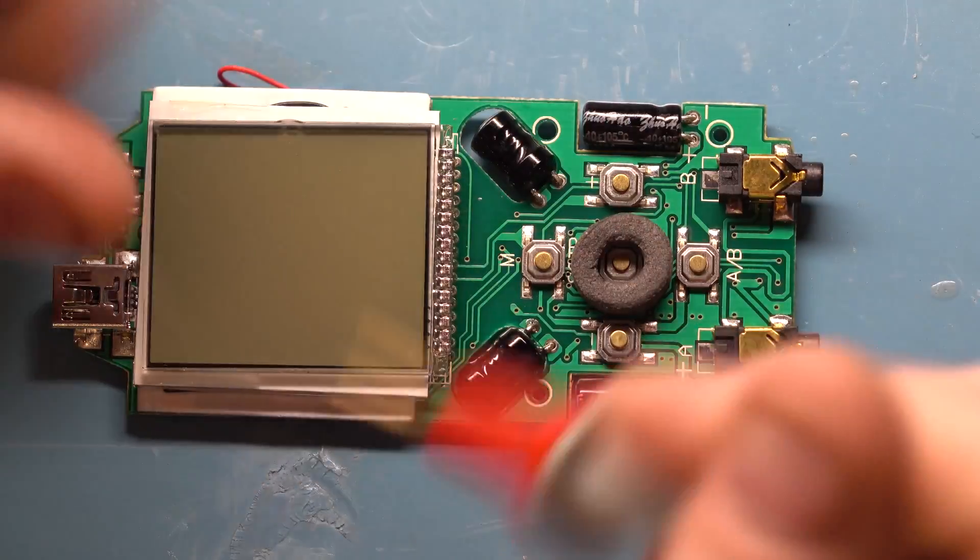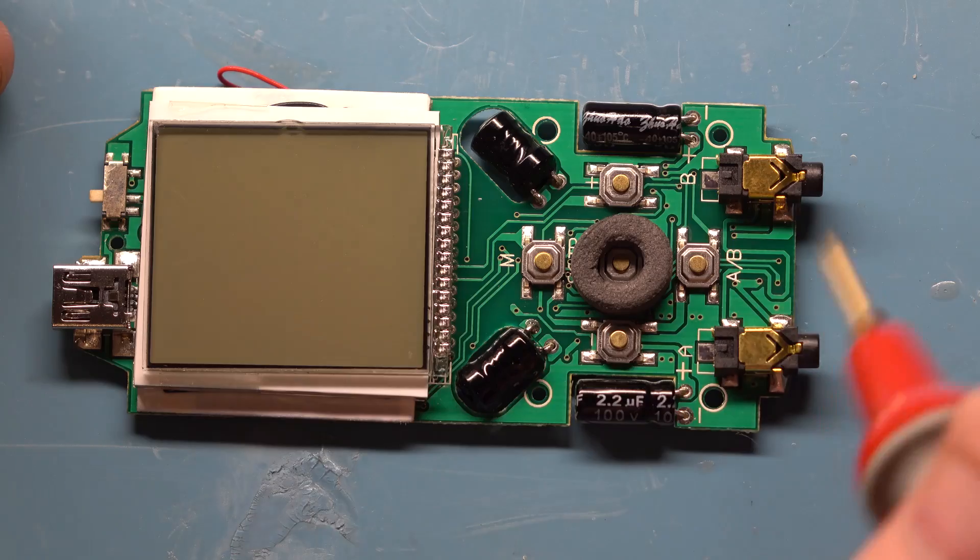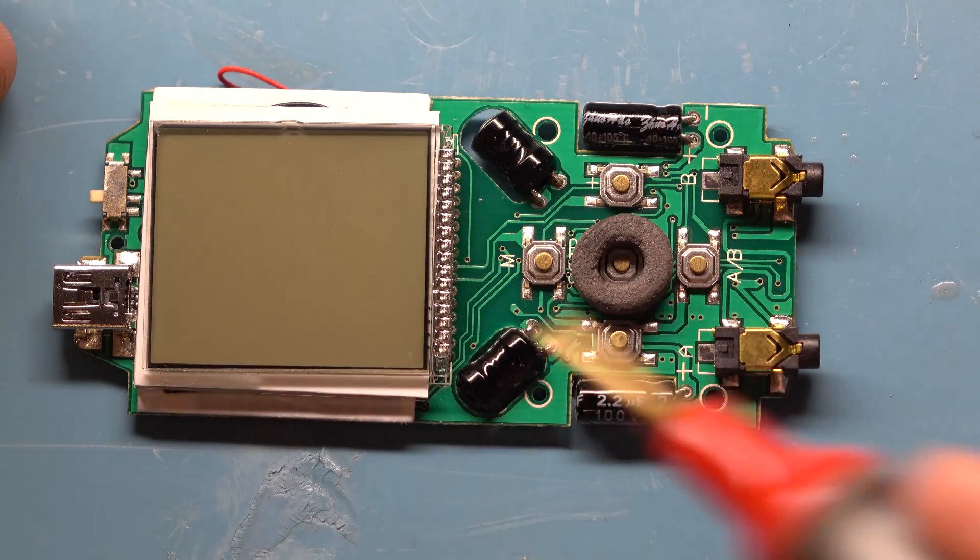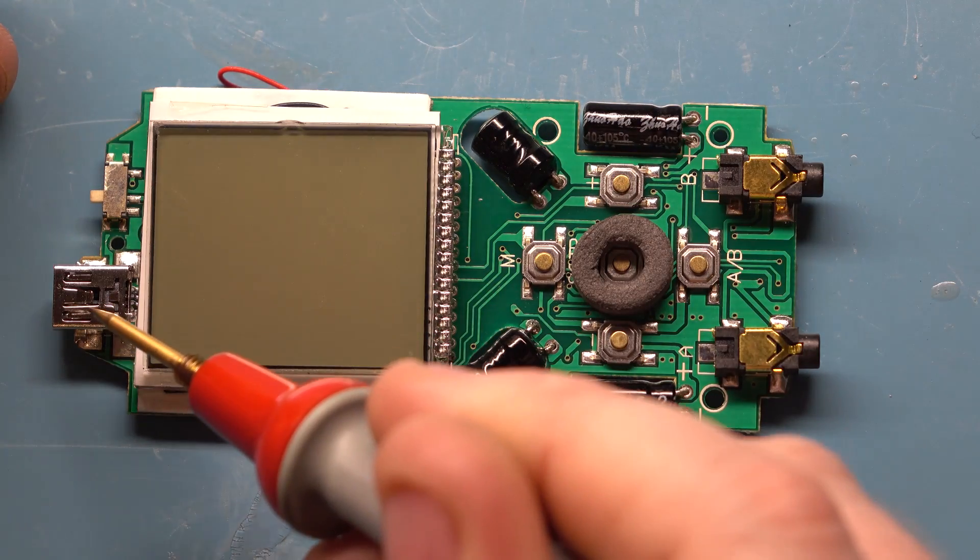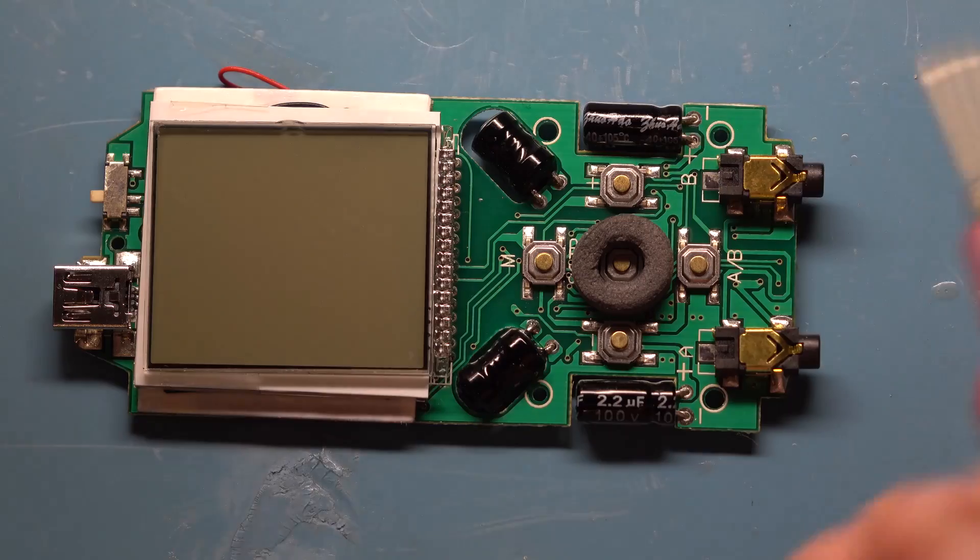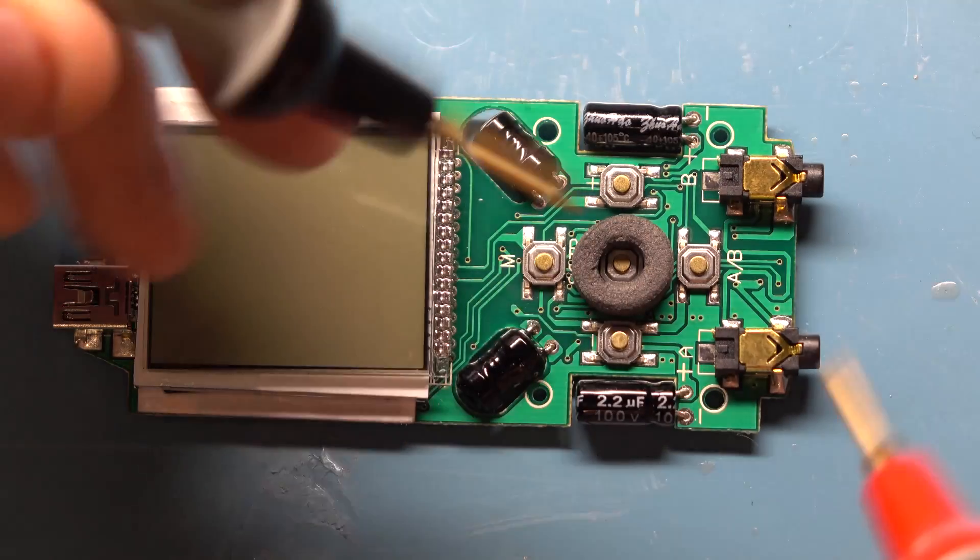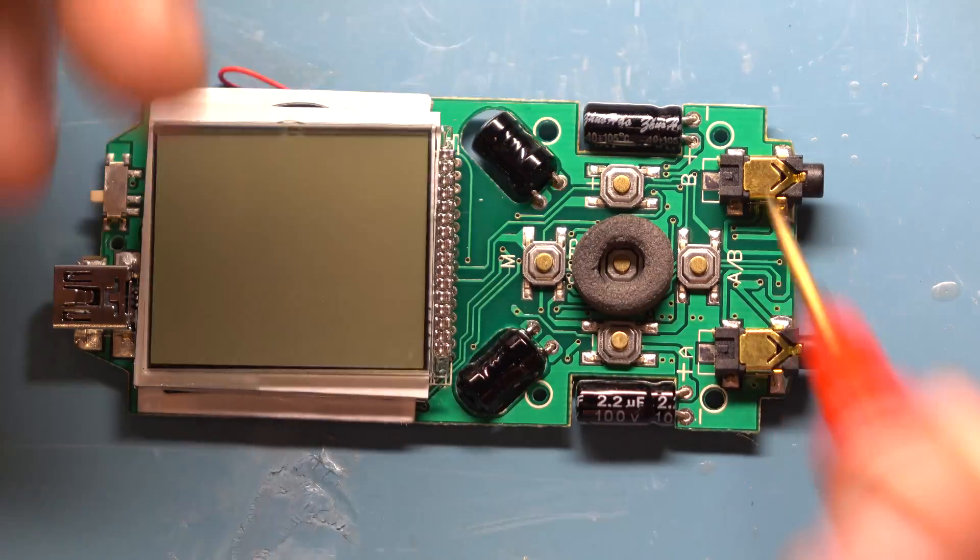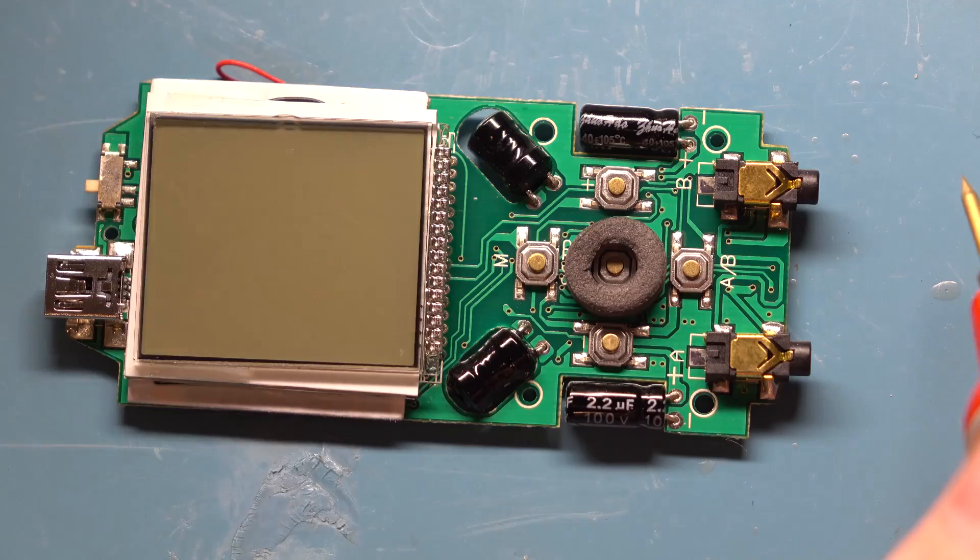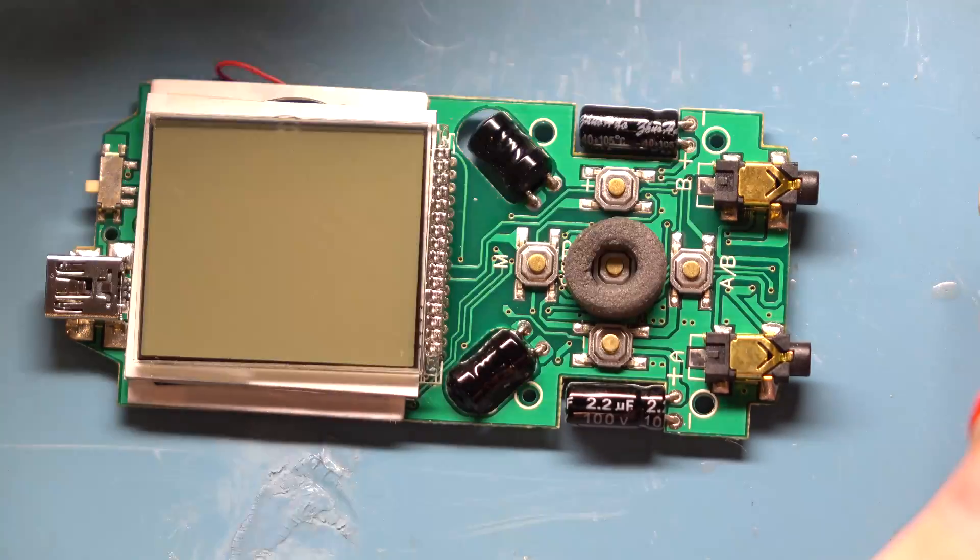Okay, so here's the board taken out of the enclosure. This is the front of the board. LCD display here, you have the USB port for charging, slide switch for on-off. These are the two jacks for connecting the electrodes.